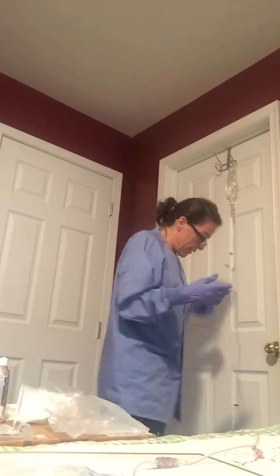And now I'll attach the primary tubing to the extension tubing and just twist that there. All right, leave that there. And I'm not going to do this, but I would open up my drip clamp so that the medication would start flowing.